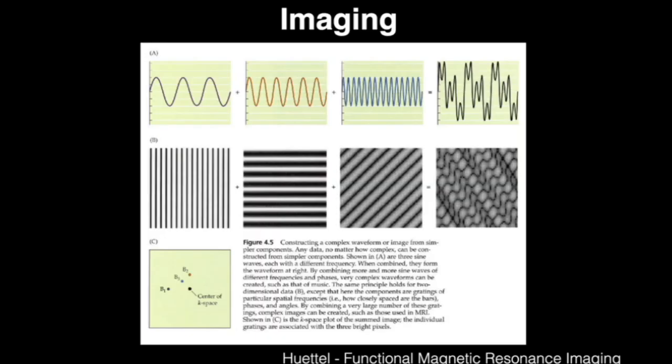Fourier essentially expands that concept to multiple dimensions. So if you have things that vary at different frequencies along a certain axis, if you have enough of them, you can use those to create any 2D, 3D, 4D representation. And that's what this diagram here is trying to show.